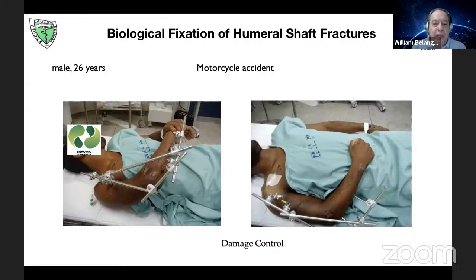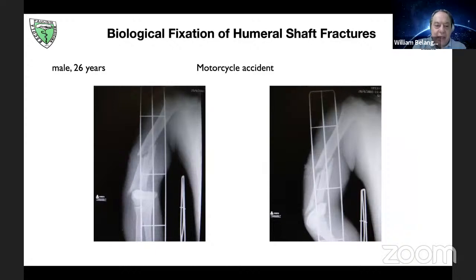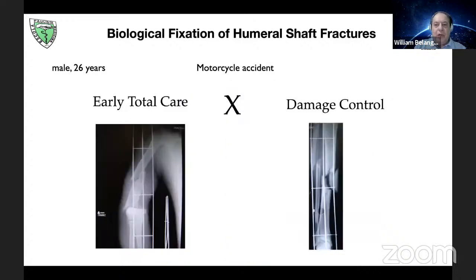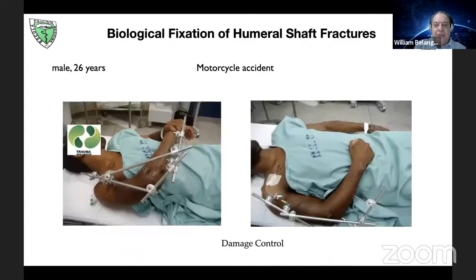And I'd like to pose a question for you. I'd like to see the length of the humeral distal fragment, because this is the key to define the treatment. This is very important because usually this fragment is flexed, or you can see exactly the length of the distal fragment. Yes, you see the fragment on top. It's not the correct length. This is a very important image that you need. Another point for the young guys who are seeing this presentation: this is a very good example to treat by biological concept. This is a fracture where you need to use biological concept to treat a humeral shaft fracture in this condition. I think this is a very good example.